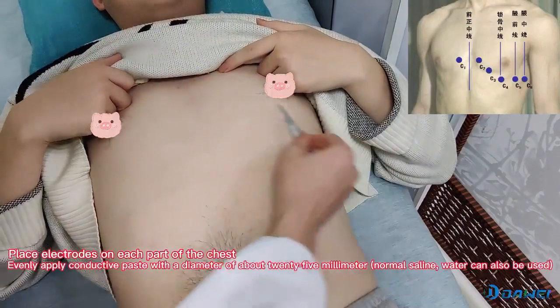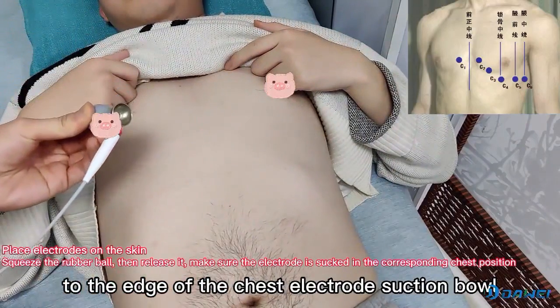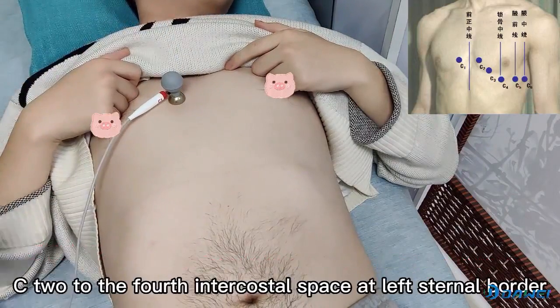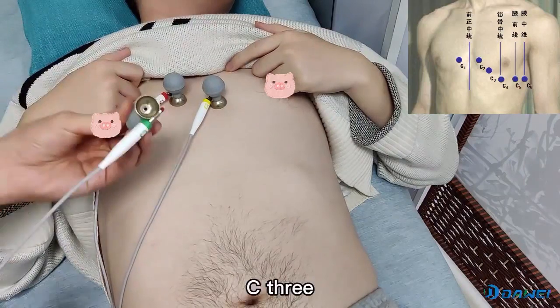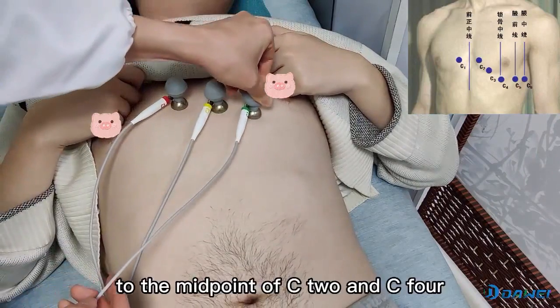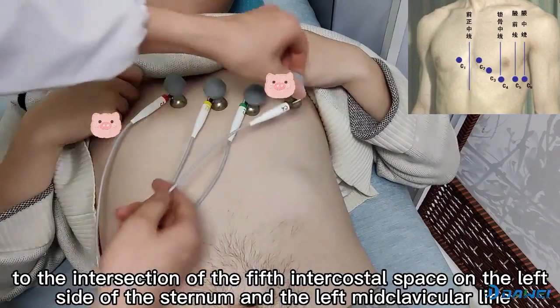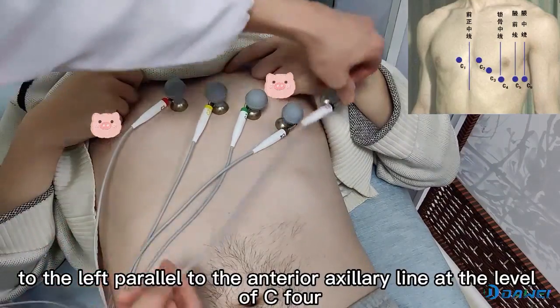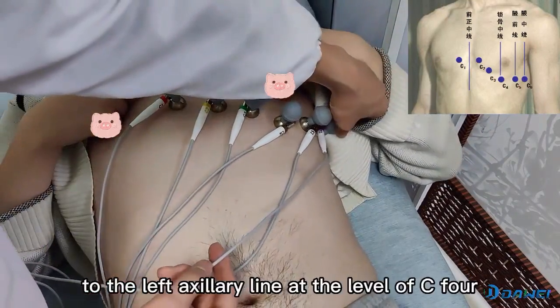Yellow lead connects to the left hand. Clean the skin at the chest electrode sites and apply a thin layer of conductive gel evenly to the edge of the chest electrode suction cups. C1 to the fourth intercostal space on the right sternal border. C2 to the fourth intercostal space at the left sternal border. C3 to the midpoint of C2 and C4. C4 to the intersection of the fifth intercostal space on the left side of the sternum and the left mid-clavicular line. C5 to the left, parallel to the anterior axillary line at the level of C4. C6 to the left axillary line at the level of C4.